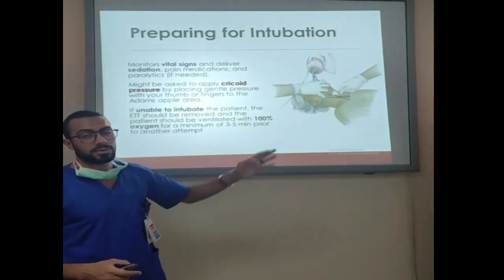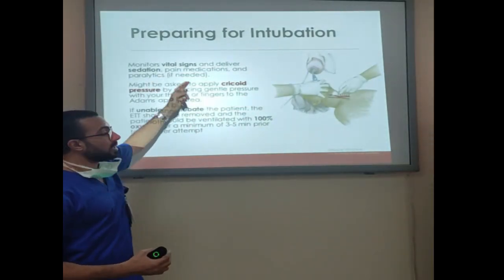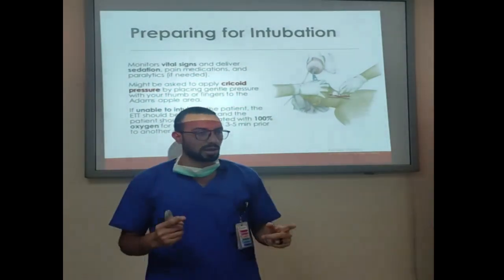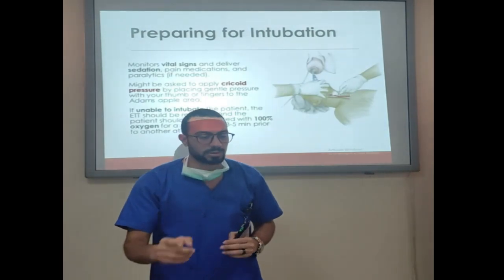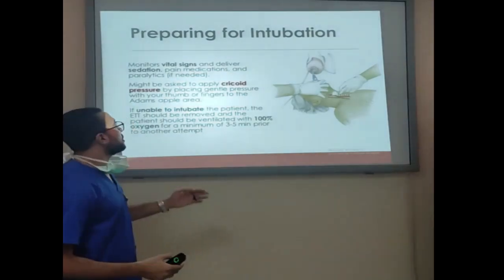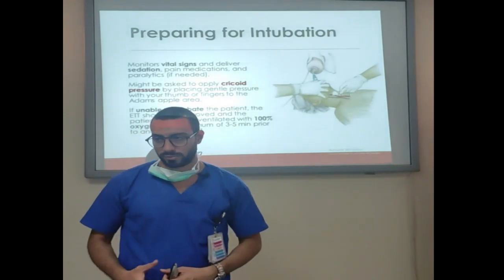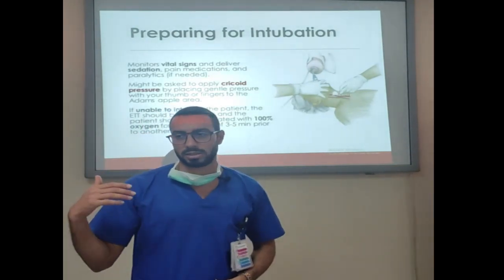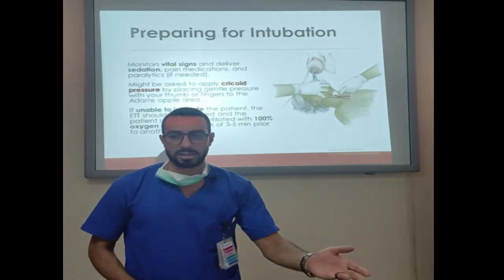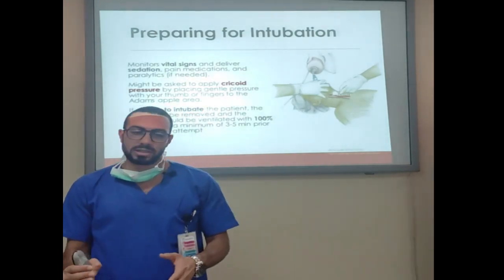First of all, during the intubation, our role mainly is just to help and take care of the vital signs. The doctor will concentrate on the airway and inserting the tube. During this moment, our role is to take care of the whole patient. You should take care of the vital signs, and also, if you will give sedation, prepare the medications for the induction for the intubation, like the sedation and the muscle relaxant. Normally in our RCU, we give just fentanyl, midazolam, and rocuronium, the muscle relaxant. So anyway, you will prepare everything and be ready.